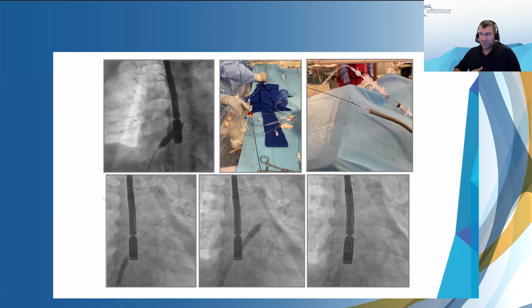So I don't know if Nadira or Paul, you want to comment on that? No, we would have never gotten across without the balloon assisted tracking because the septal patch was so thick. It wouldn't matter how we dilated, the transition would have been too great. So credit to Matt, our angiovac rep, who walked me through this to make sure I was doing it right. And so it went across really well.